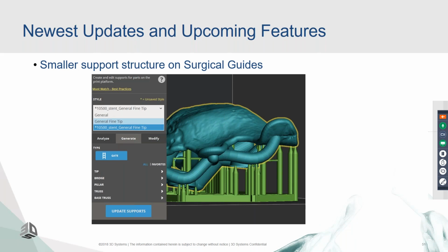So we've added finer support structures. This is already in your 3D Sprint. When you go to Nest, just choose General Fine Tip. Usually it'll default to general, but if you want a finer tip, just hit General Fine Tip.